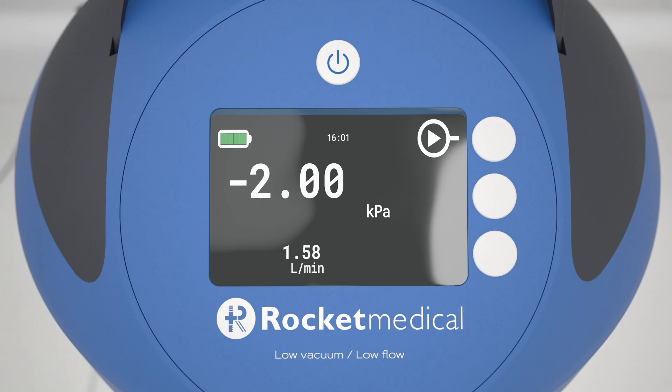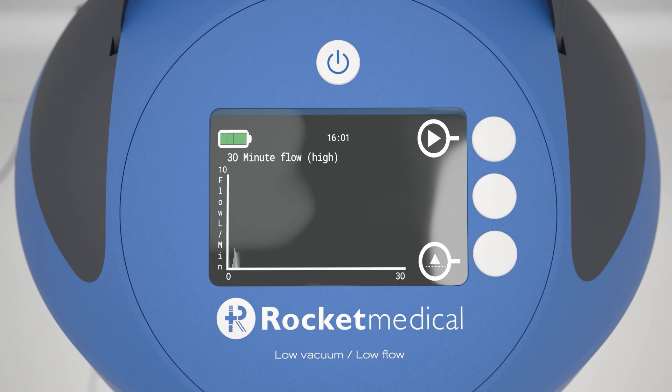You can scroll through the screens by pressing button number 1. Screen 2 shows the suction level and duration of suction applied. Screen 3 shows a flow versus time graph. Press button 3 to rotate through three different display options.